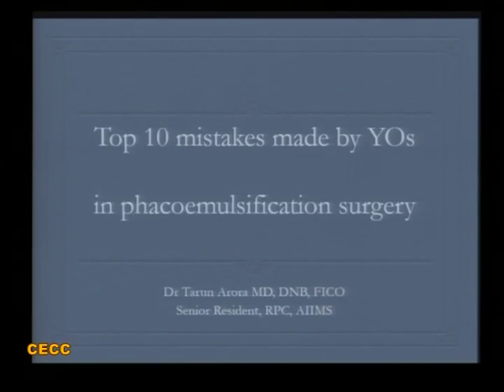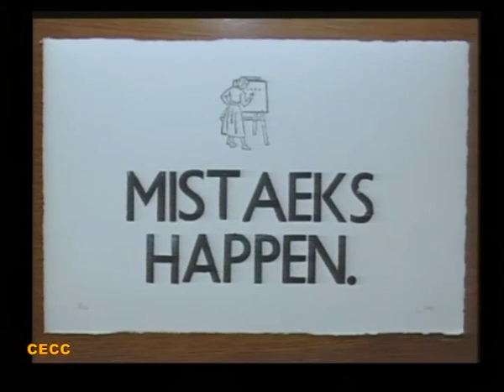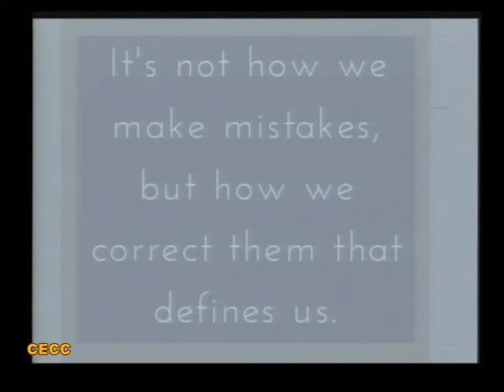I will be presenting the top 10 mistakes made by the young ophthalmologist in phacoemulsification surgery. This is a video-based compilation of some surgeries done by me and some while I was assisting trainees, the junior residents. The important thing to realize is that mistakes do happen, but it is not how we make mistakes but how we correct them that eventually defines us.